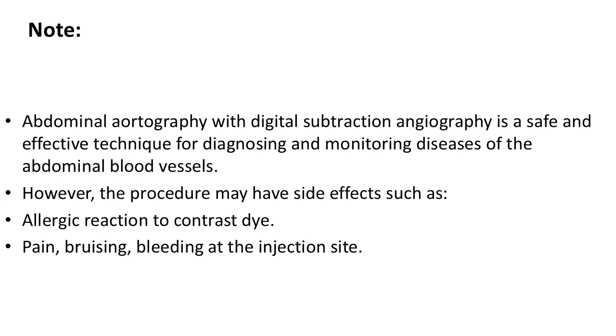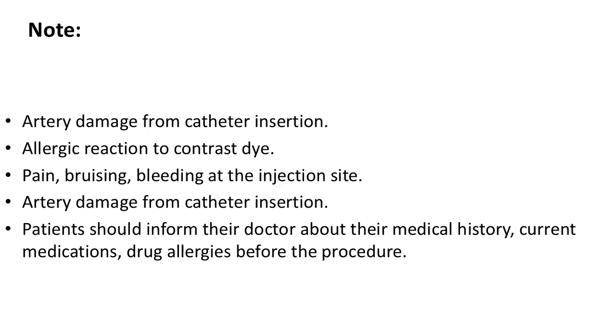However, the procedure may have side effects such as allergic reaction to contrast dye, pain, bruising, bleeding at the injection site, and artery damage from catheter insertion. Patients should inform their doctor about their medical history, current medications, and drug allergies before the procedure.